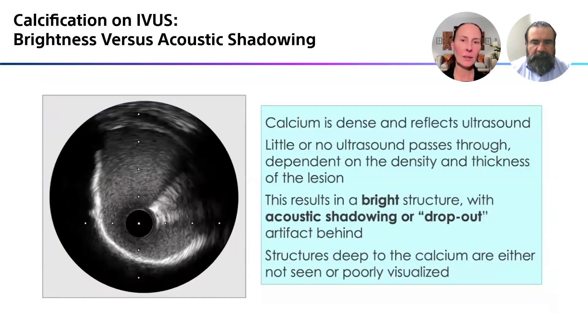So what about calcium? Calcium on ultrasound is very dense, so it reflects all of that ultrasound — not many of those ultrasound waves get through the calcium at all. This results in the bright structure that you see from about four o'clock to eleven o'clock. And because the waves don't pass through the calcium, what you're going to see behind it is just darkness, or what we call dropout artifact.